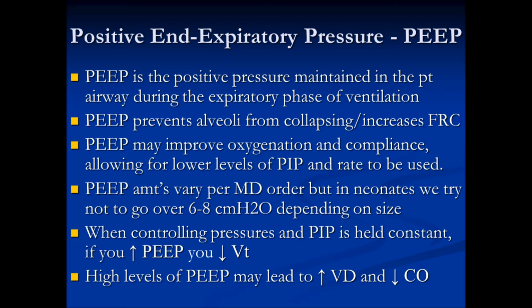And the last thing about cardiac output, hopefully it makes sense to you that when you have high levels of PEEP, you will cause there to be more pressure in the thoracic cage, therefore causing vasoconstriction, thereby causing the heart not to be able to kick out as much as it normally does, because that increases afterload, and the heart would have to work harder to overcome that.